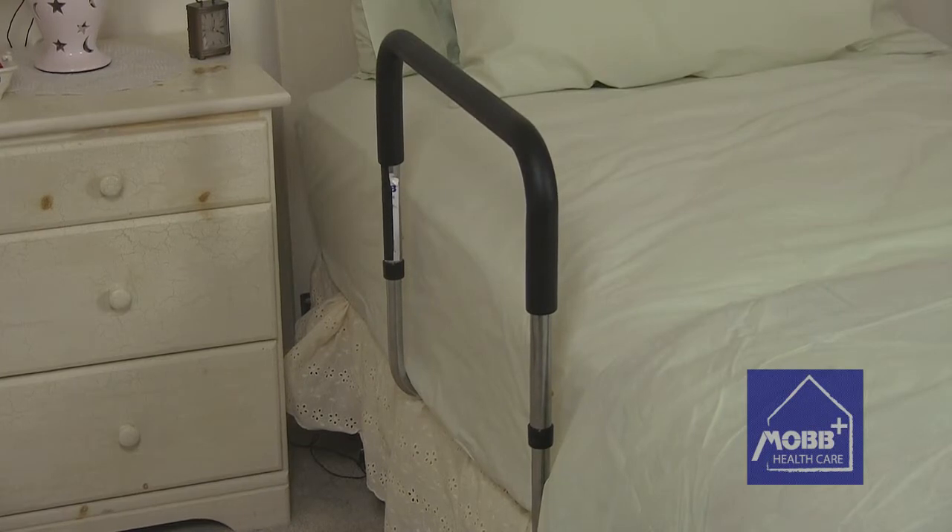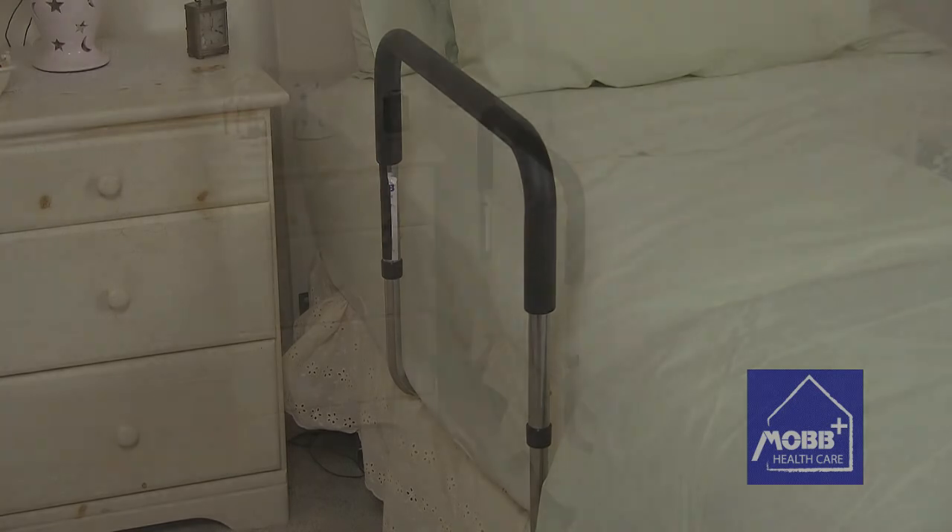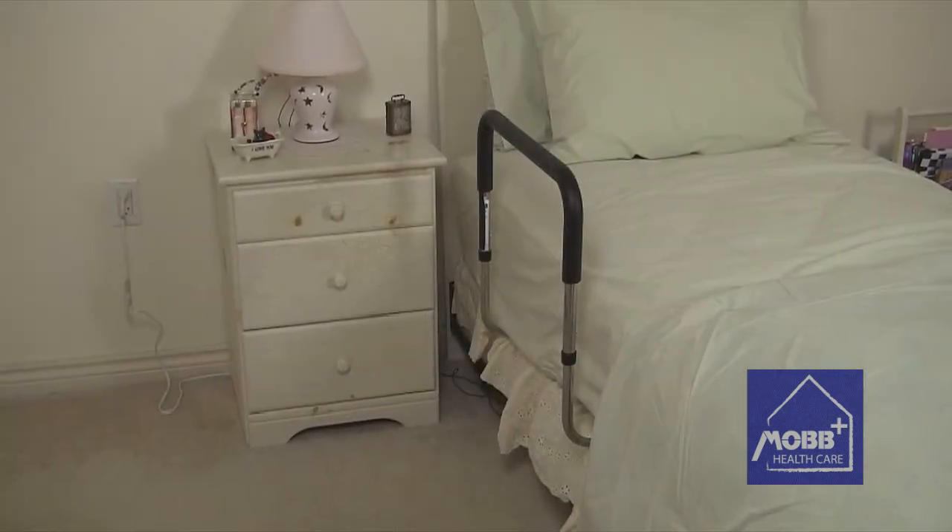Unlike fixed-style bed rails, our Bed Assist Rail is designed for quick and easy installation and removal, and can be used on either side of the bed.